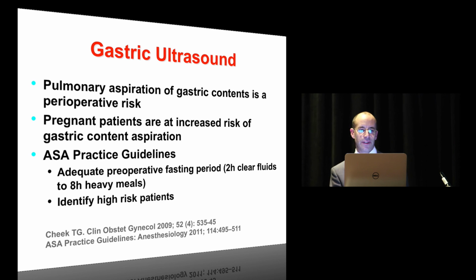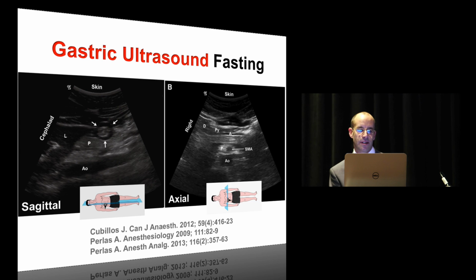And I'm going to end off with the gastric ultrasound. As you're aware, it's one of our concerns in OB because women are at high risk for aspiration. And what we have to rely on is purely time-based guidelines, and we follow the ASA guidelines in terms of whether or not the stomach is emptied. So wouldn't it be nice to have an ability to look into the stomach and say, is there actually food or something in there? This is an area that the Toronto group is working at, in particular Perlis and colleagues, and they've done some remarkable work, but this is really still early days. If you're bored one day and you want to play around with it, you can start seeing if you can actually see something.